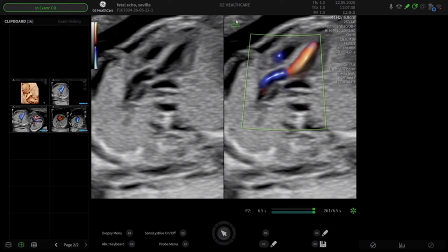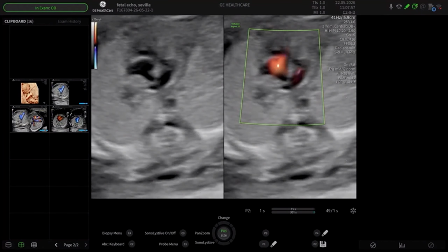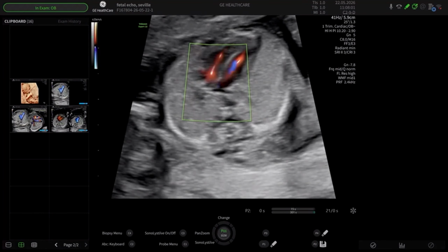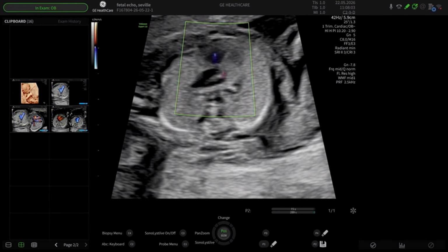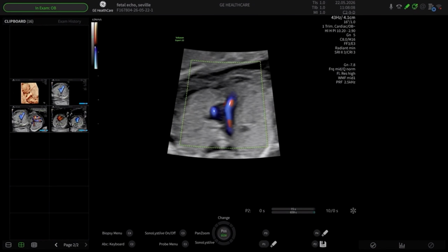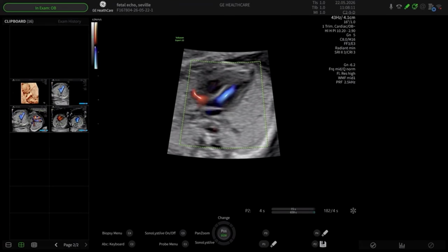with the interventricular septum. So I've moved up from a stomach to a four-chamber to a left ventricular outflow tract, and the first thing you see from moving four-chamber going up to the three-vessel tracheal view is the left ventricular outflow tract. And then I go back to my four-chamber view on a single screen, just reduce my magnification, and I'm now going to sweep from a right ventricle up to showing the right ventricular outflow tract. I'm going to slightly increase my color gain.